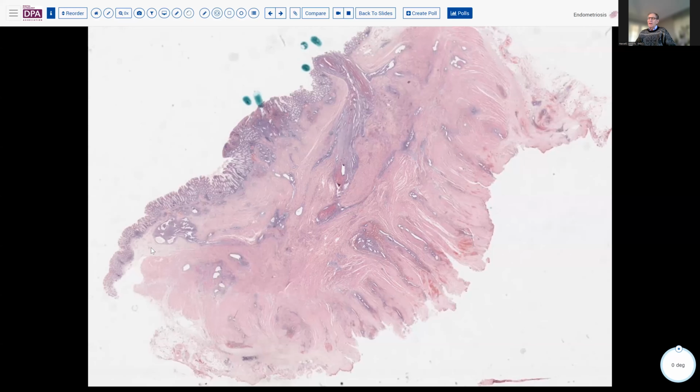Some cases we've seen in the bowel, such as this, can be quite florid, extending up into the surface, but involving really all levels of the bowel wall, as you can see here in the muscularis and out onto the serosa. This is not likely to be an invasive process, but seems to be more likely to be hematogenous or lymphatic spread in this circumstance.